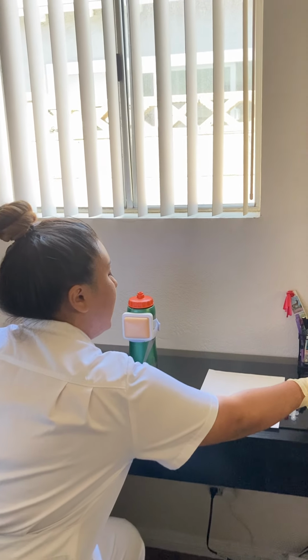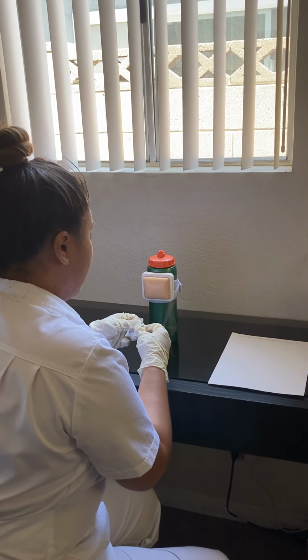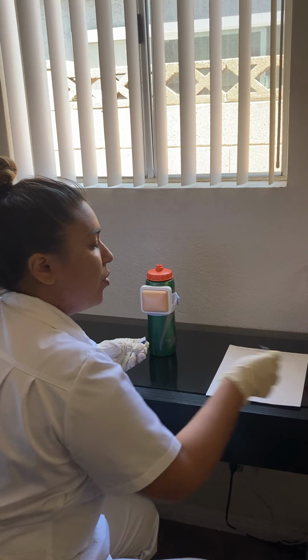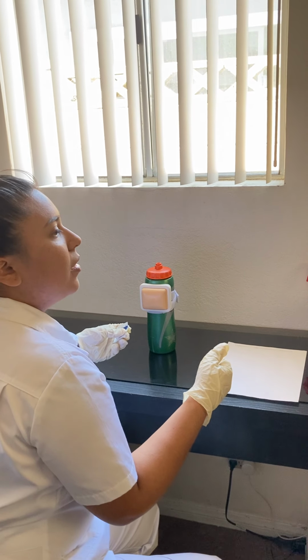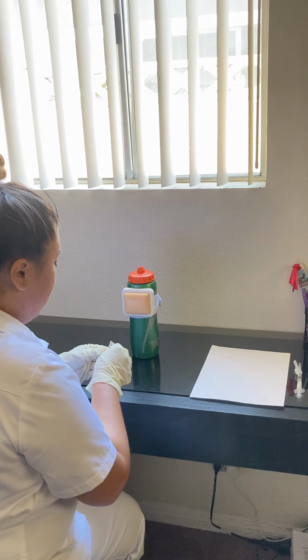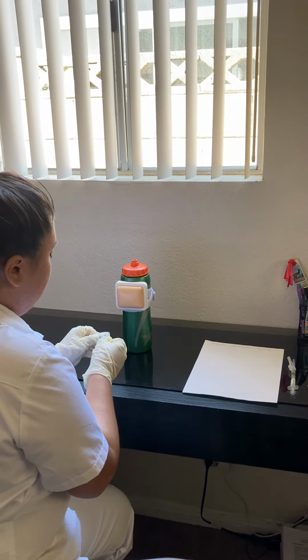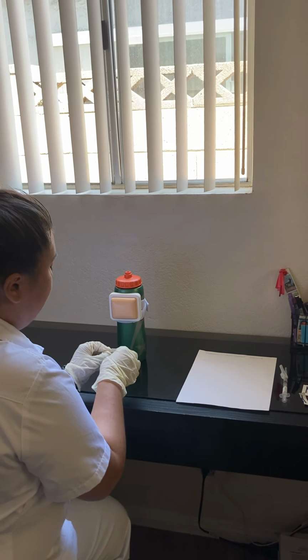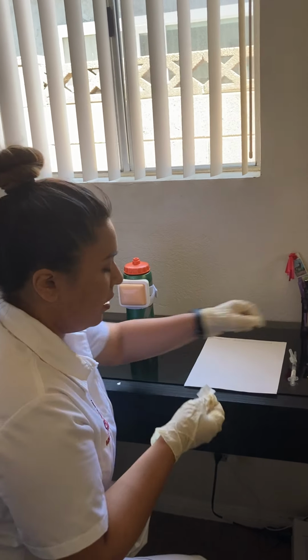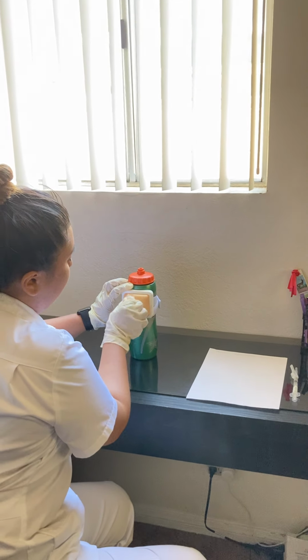So I'm going to go ahead and clean the site. And before doing this, I would have checked the patient's ID, but I did that during the IPI. So I'm going to go ahead and proceed. So I'm going to go ahead and clean the site using a spiral motion going outward.